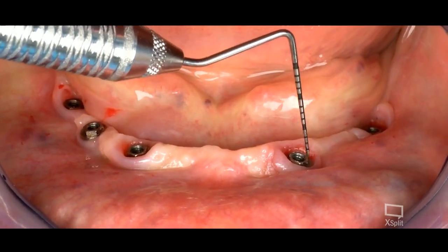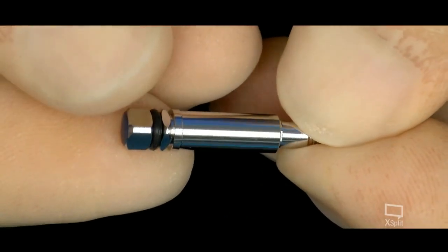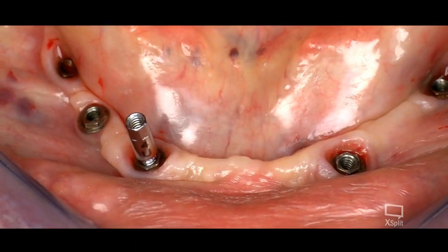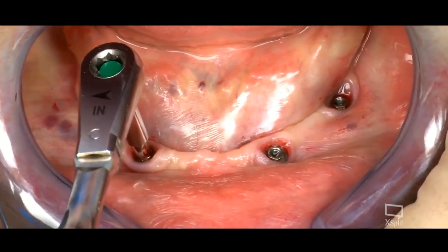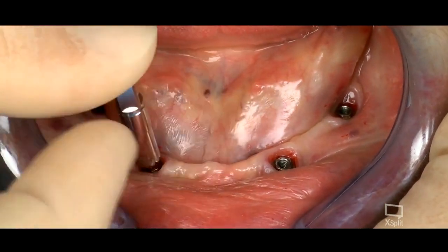Here you see the doctor is controlling the implants, and he first removed the old implants, and you can see that the implant came out really easy. That was the problem.